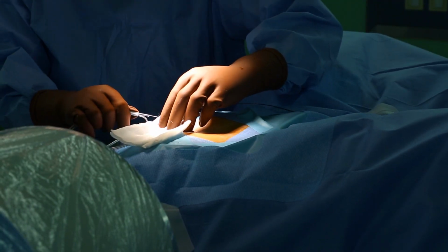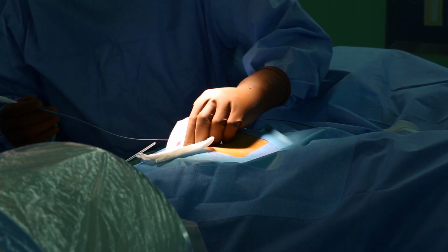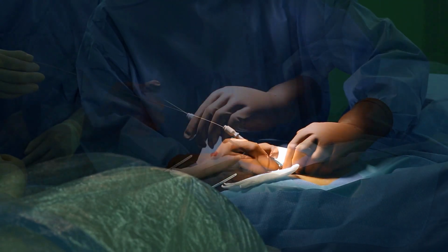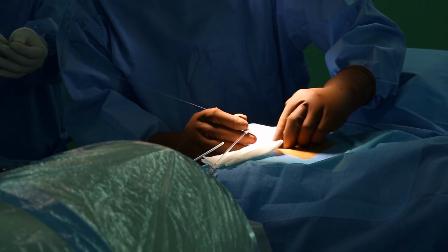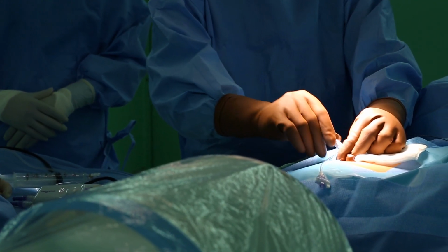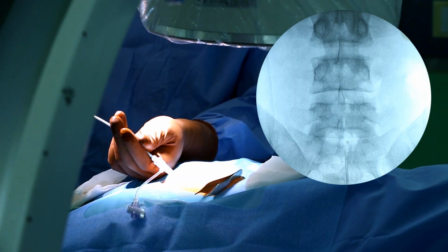Place the guide wire into the hiatus through the needle. Remove the needle, leaving the guide wire in the hiatus, and then the dilator is introduced over the guide wire. Remove the dilator and then put the stylet and sheath onto the guide wire. After the stylet and sheath are placed in the hiatus, take out the guide wire. Remove the stylet, leaving the sheath in the hiatus. Insert the catheter into the targeted treatment point over the sheath.